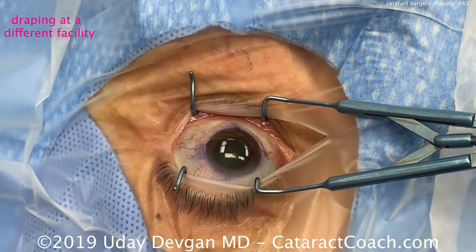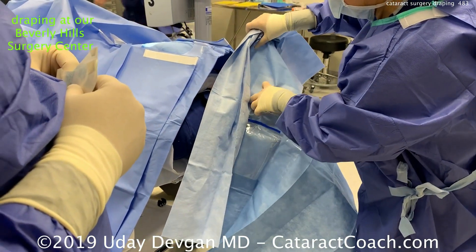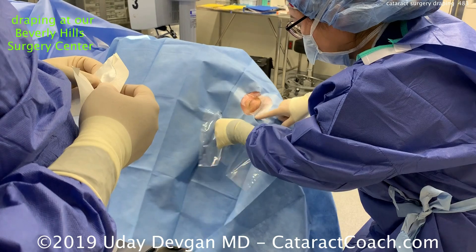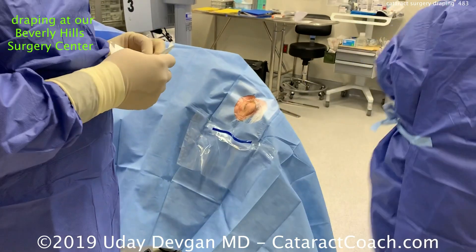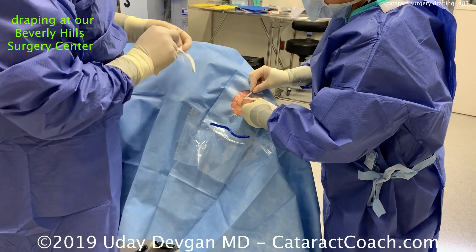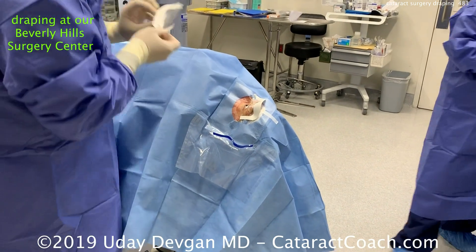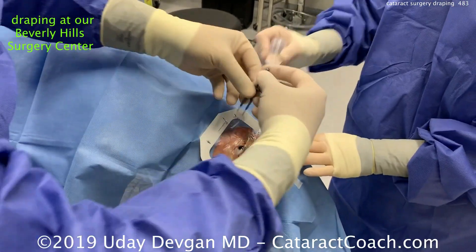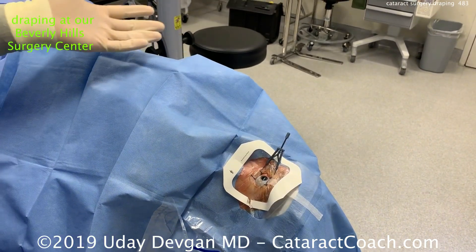Isolating the lash margin avoids contamination by oil and debris. Let's go back to Beverly Hills. The cutout drape goes on first — it has a built-in pouch to catch fluid. In my right hand is the Tegaderm drape cut in half. My assistant uses a single Steri-Strip to open up the eyelid. There's a Tegaderm placed on the upper eyelid and another on the lower eyelid, never touching the eyelid with my gloved hands. Speculum goes in the eye and we're ready to go. However you do it, let me know.